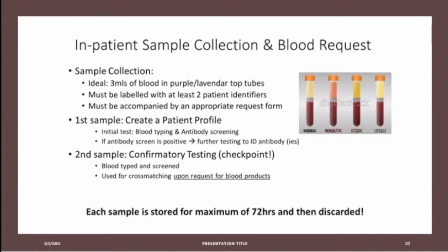So we implemented this policy where each patient whose history we do not have in our system, we will require you to do a second draw in order for confirmation of the blood bank of the ABO to occur.